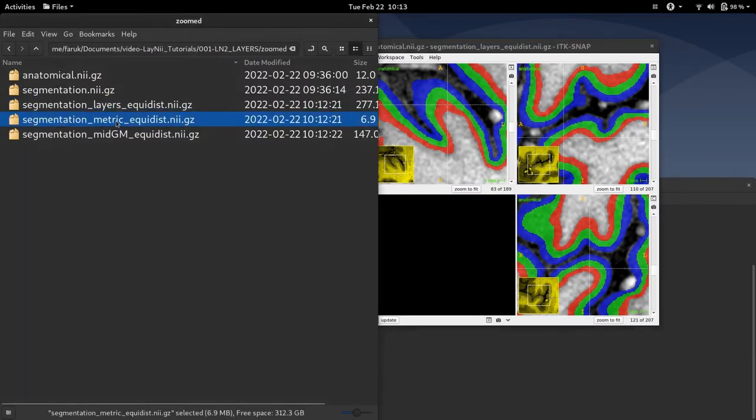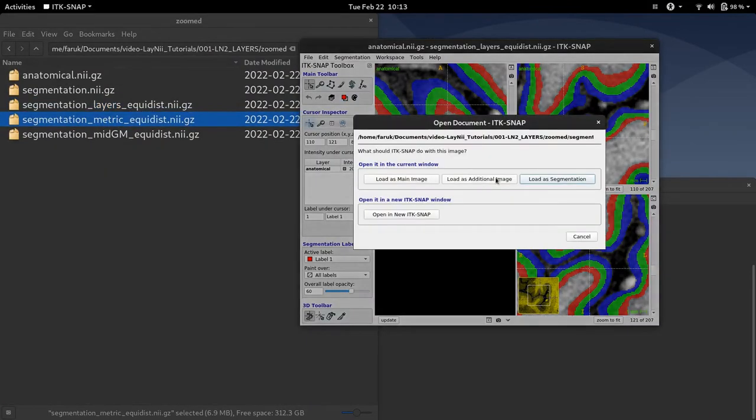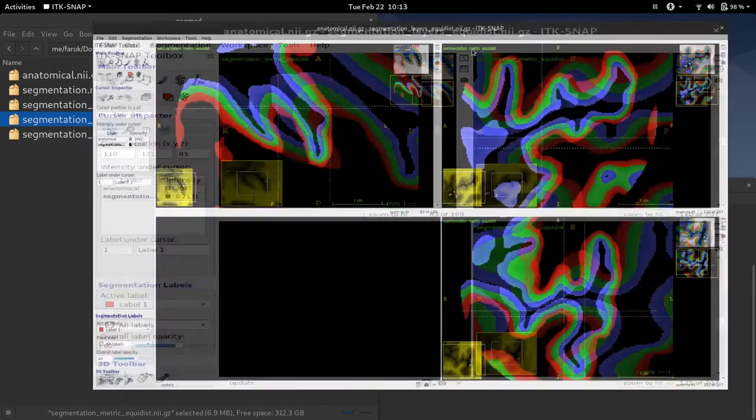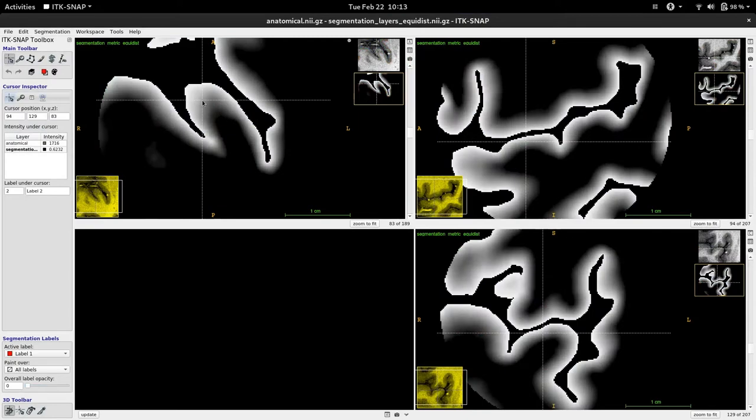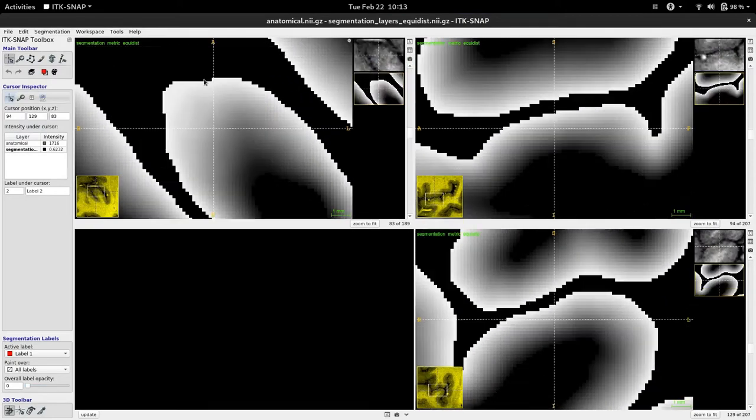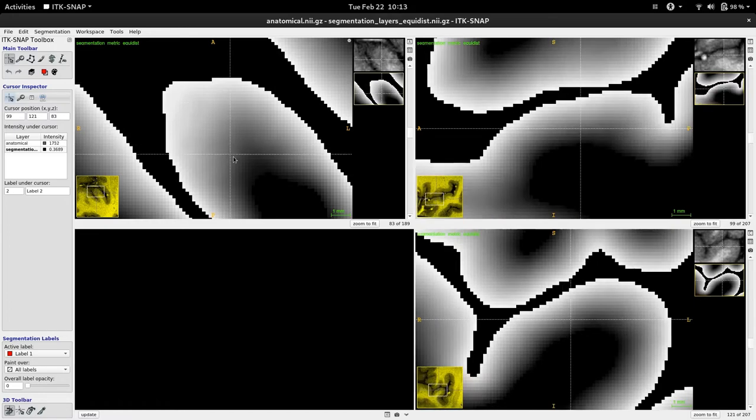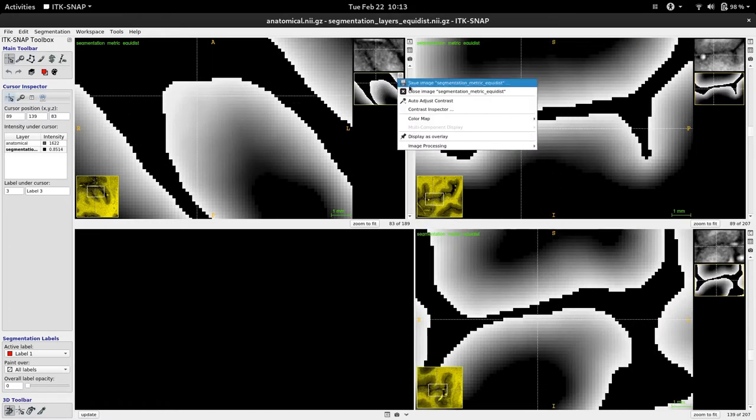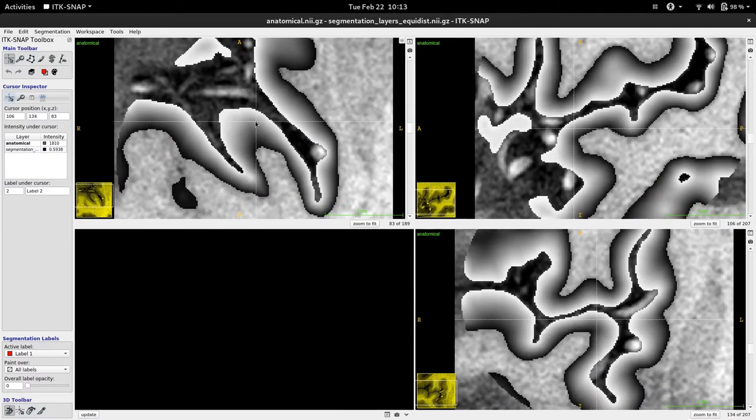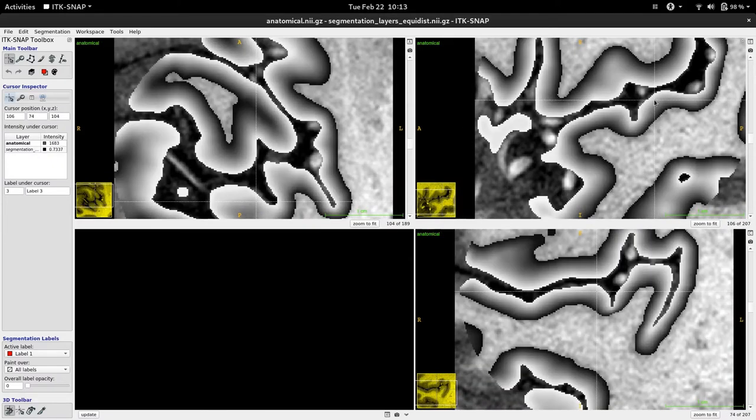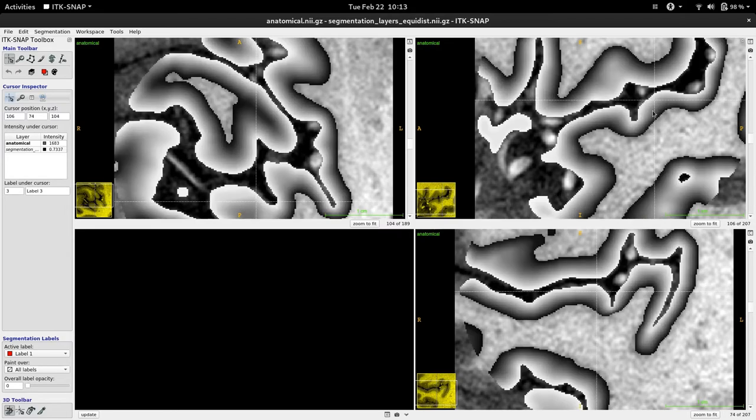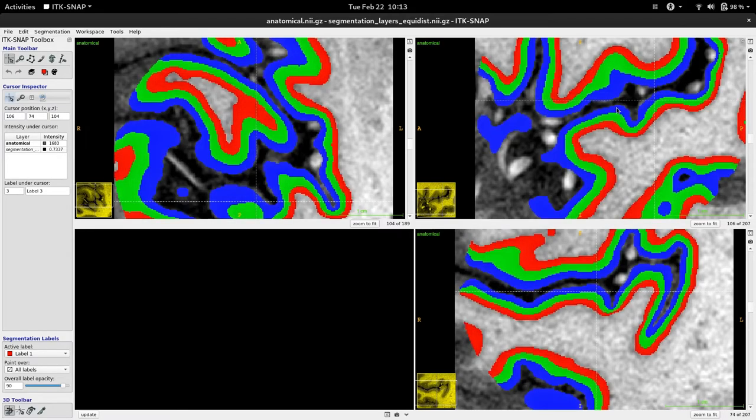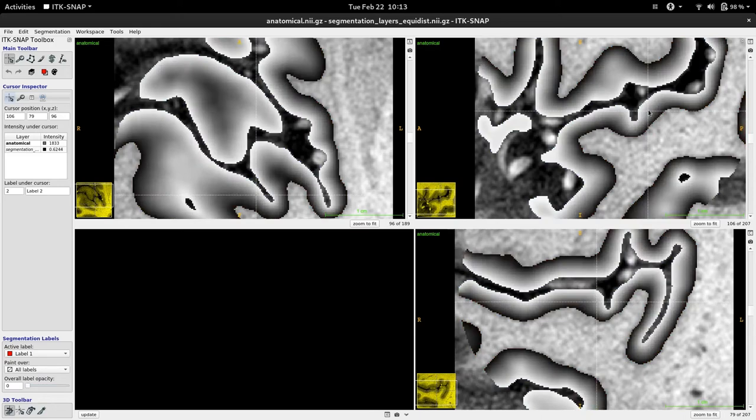Which is this metric file. So if you load this file as an additional image, you will see that this file has a value between 0 and 1 for every gray matter voxel. We can actually load it as an overlay in ITK-SNAP to see how it corresponds to the gray matter. And basically the layers file is just a binned version of this metric file.